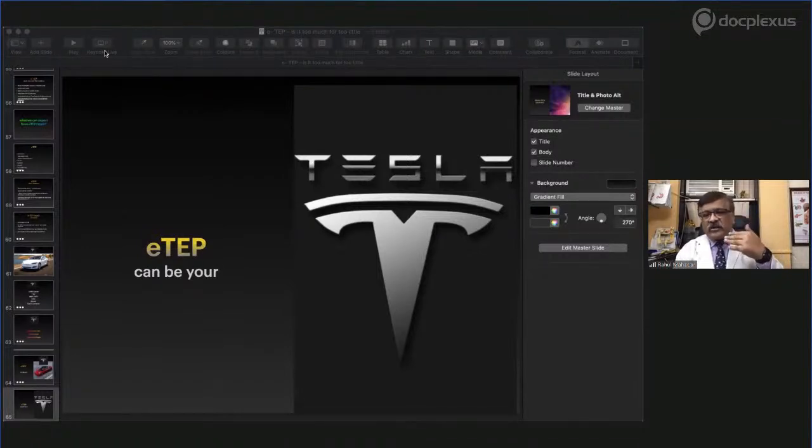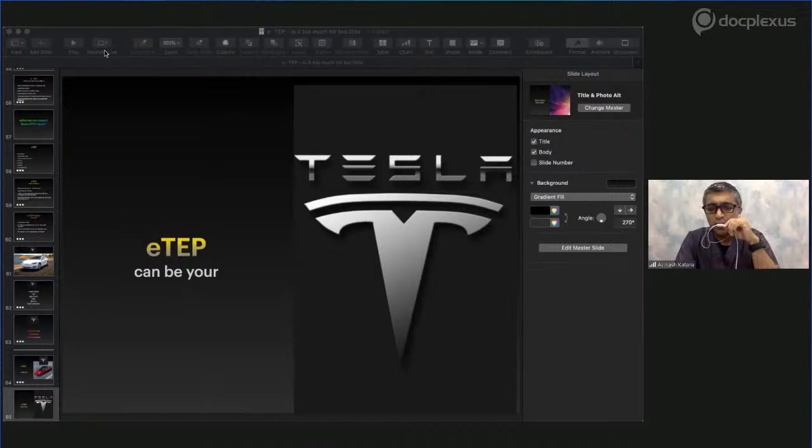So there is no necessity, but you can take approximately 10 centimeters on both sides, laterally up to the linea semilunaris, and that part is measured before putting the mesh, and according to that we can calculate the mesh. But many times what we have observed is that the size most commonly required is almost 24 by 15 or 14 size mesh. That is what is required for these particular repairs. Okay, thank you. Are there any more questions from the audience, Shiva?